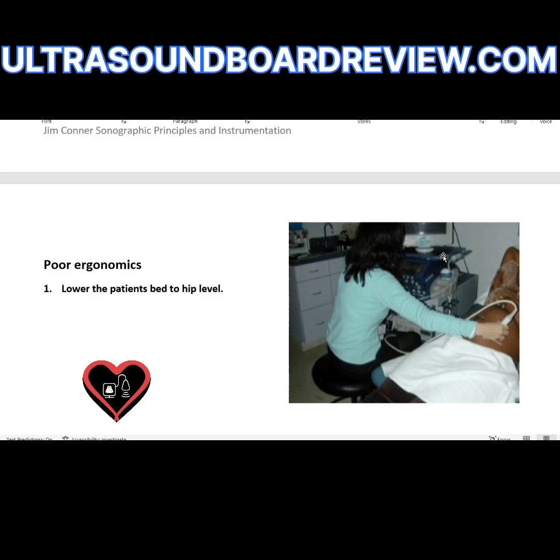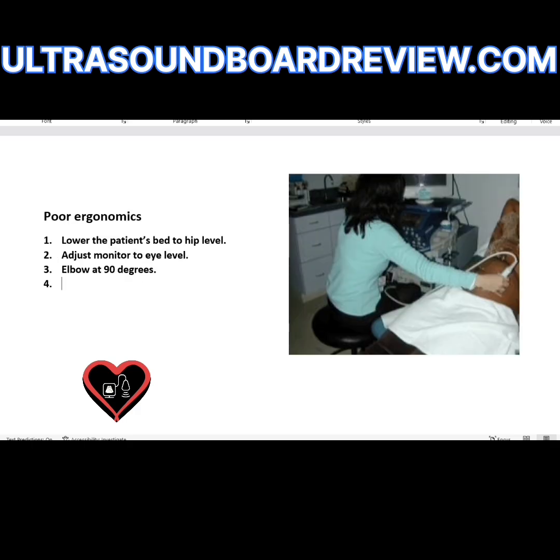What about the monitor? I think it's too high — she's kind of looking up. So she needs to either raise the scanning chair or lower the monitor, and then adjust the patient's bed accordingly. Adjust the monitor to eye level. Maybe move the machine over to the right a little bit, or she needs to get closer to the patient. The shoulder needs to be at 30 degrees or less. Anytime you see an arm extended like that, bring it closer to the thorax — that will reduce the chances of injury.